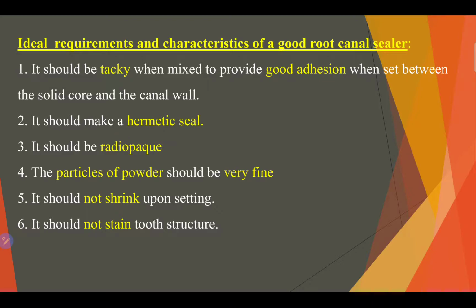When we did the mixing of the sealer previously, we talked about the drop test and the string out test. We said that it must have this string to make a very good consistency.